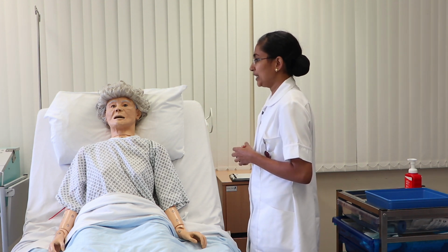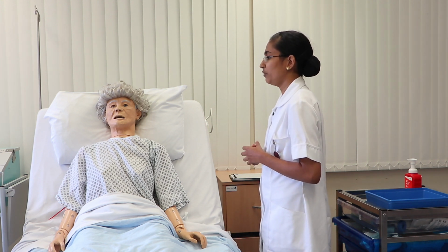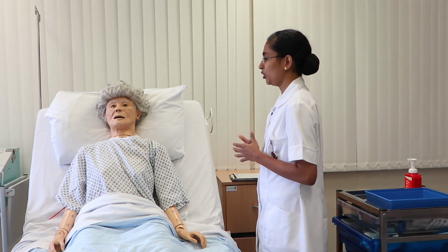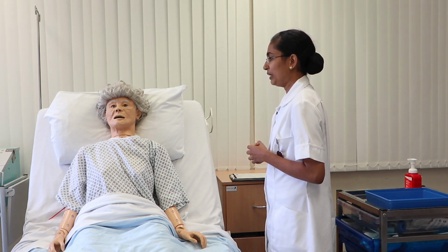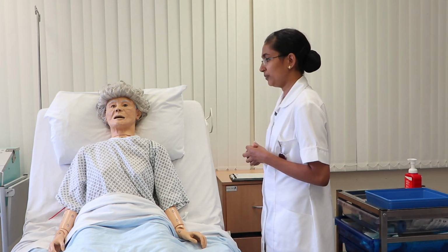Okay, so in this procedure we are using an aerochamber that I will explain to you how it will be used. Is that fine? Yeah. Okay, are you comfortable enough? Yeah. Do you still want me to continue with the procedure? Yes, please. Okay, so I will prepare the materials for the procedure. In that time, if you need me, just shout, I will be in the other room. Is that all right? Okay.